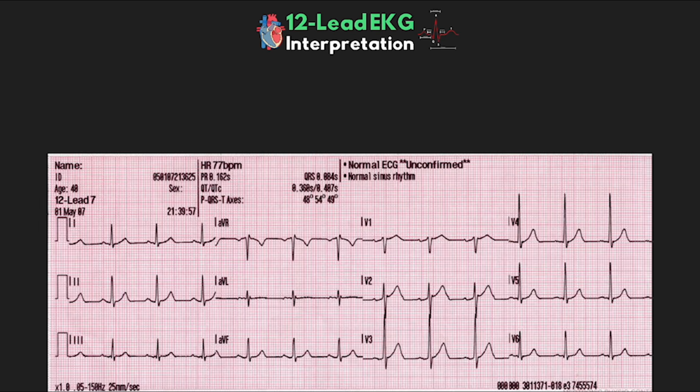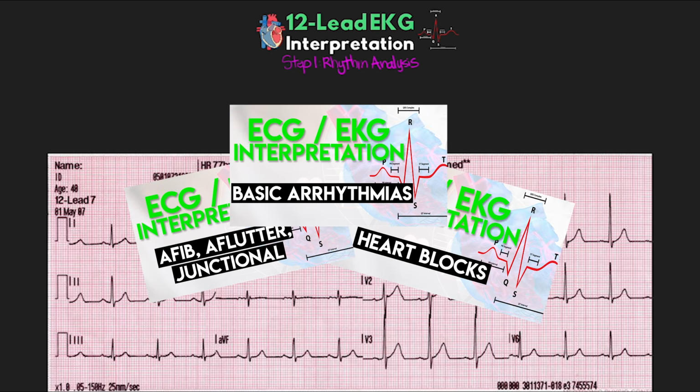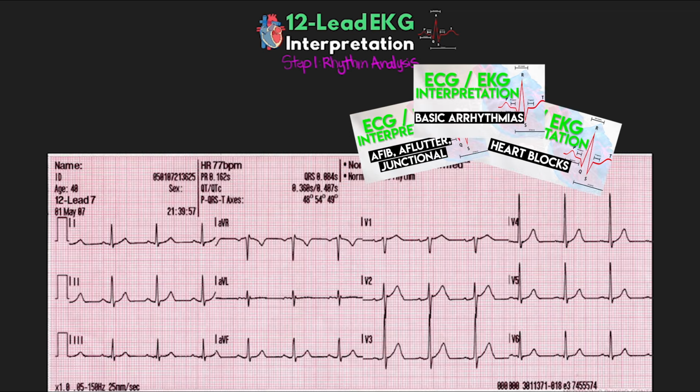Alright, so to start things off, we've got our first step, which is going to be our rhythm analysis. For this step, it's expected that you've got a good understanding of basic rhythm interpretation. So I'm really not going to be covering that in this lesson. I will link to a series of lessons that I've already put together covering all these different topics, all the blocks and all the different rhythms that you're going to need to know.